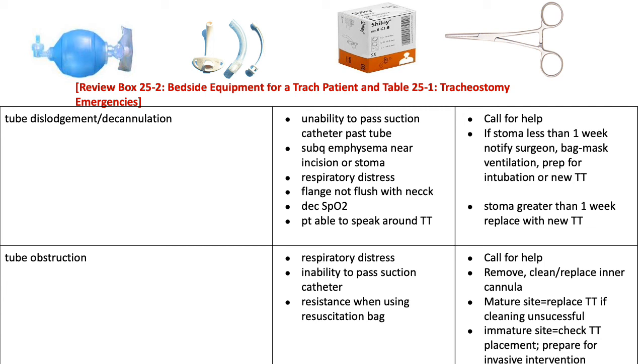You need to have extra suction catheters at the bedside in case the patient needs to be suctioned emergently. You need to have sterile normal saline at the bedside as well. That's used during suctioning, and is also used during cleaning. You'll need a manual self-inflating bag or ambu bag at the bedside to provide ventilations in case of emergency. Also, if the patient needs to be hyperoxygenated, you would need that at the bedside as well.